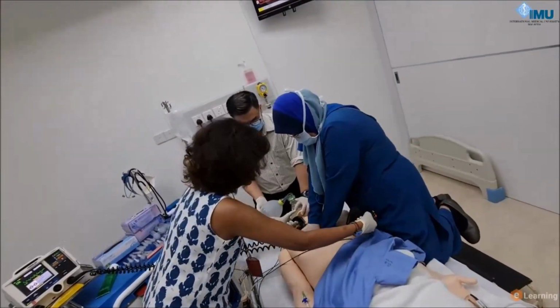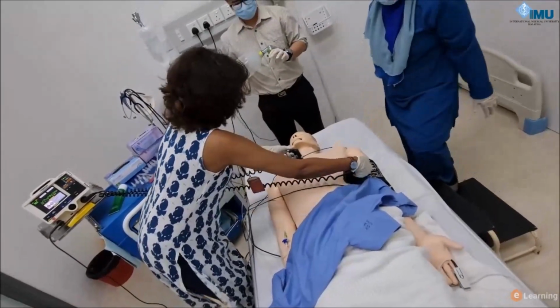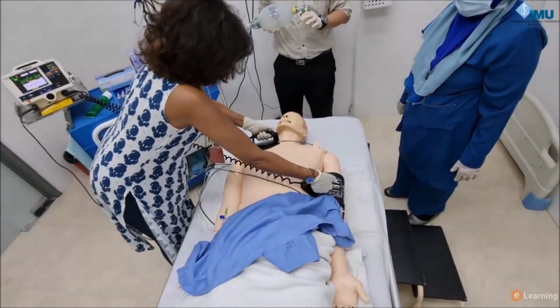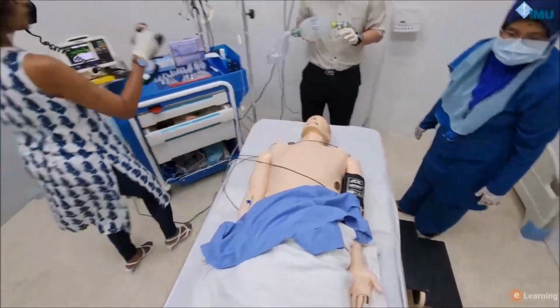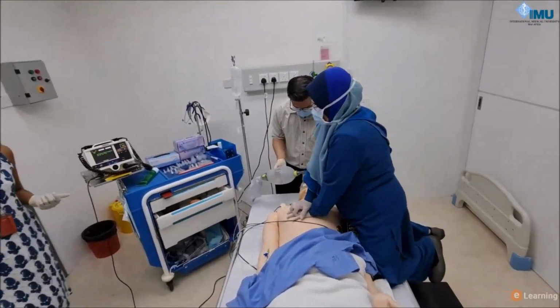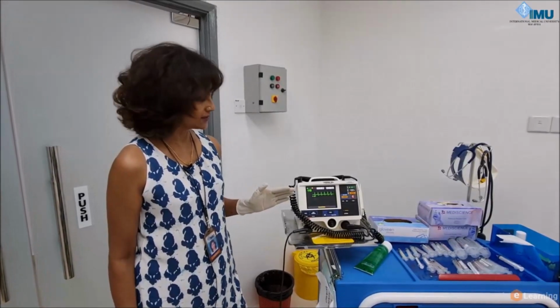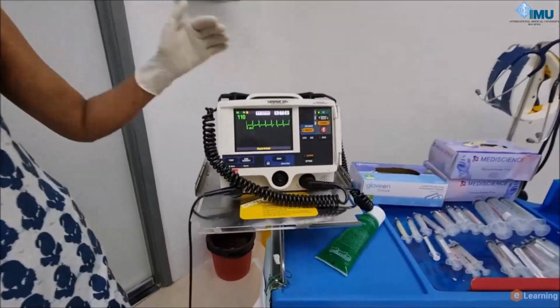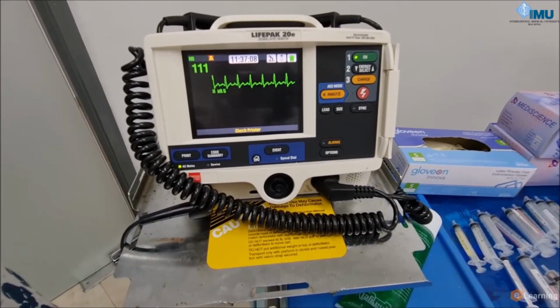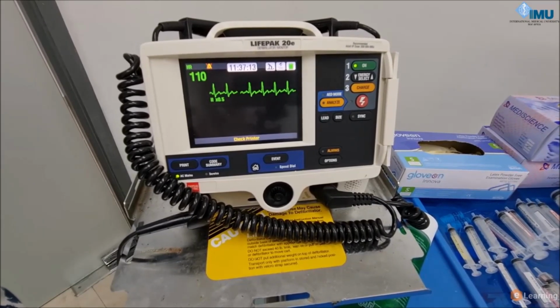Put them on. Stop CPR, please. Oxygen away. You clear, I clear, everybody clear. It's still a shockable rhythm. And I discharge. Put the continuous chest compression and mask ventilation, please. Our patient responded to the defibrillation and the VF is now converted into a sinus tachycardia. If it does not, then we will continue to shock again after another 5 cycles.